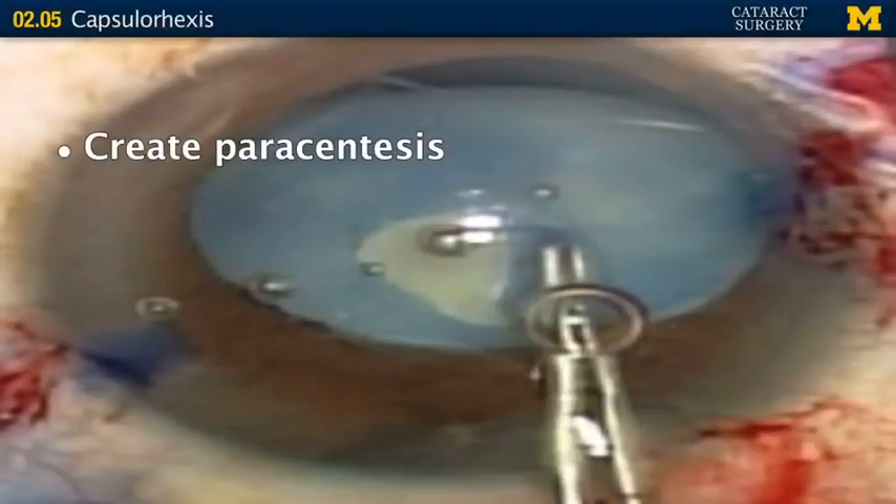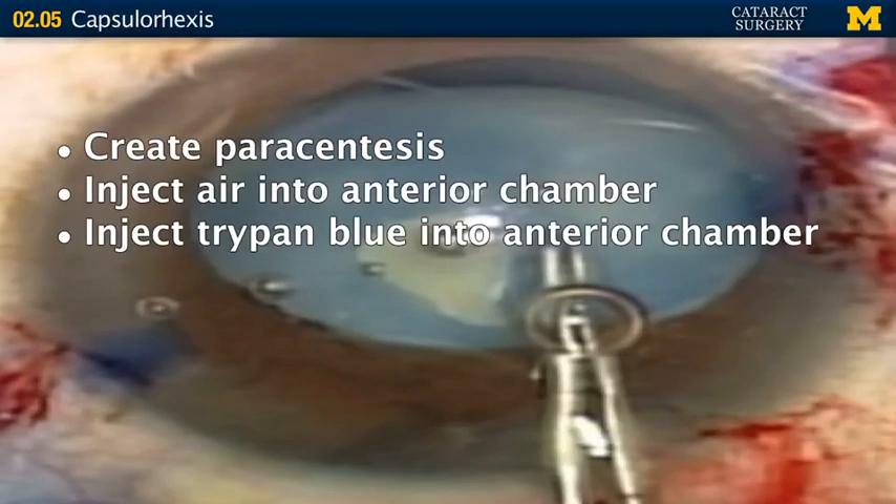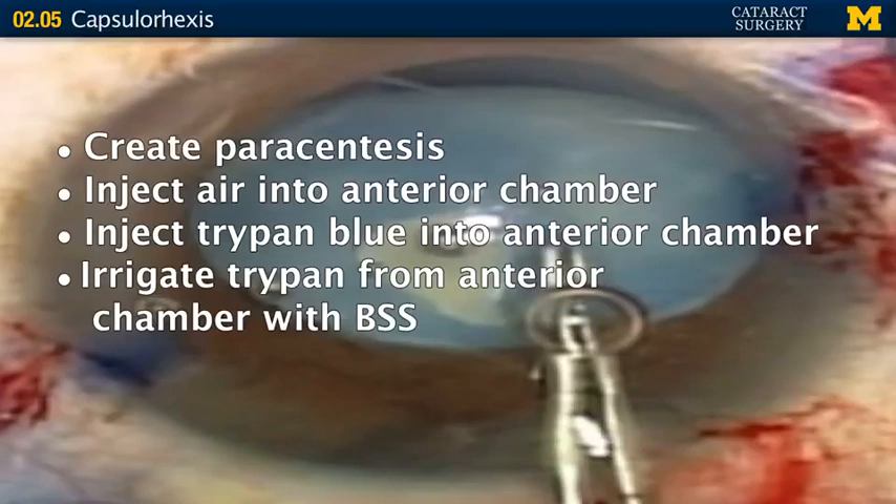You're going to create your paracentesis, and instead of immediately injecting viscoelastic, you're going to inject air into the anterior chamber. Then take your staining substance — we use trypan blue — and inject it underneath the air, at the interface between the remaining aqueous and the air, right over the lens. Once the capsule is nicely coated, irrigate the trypan blue from the anterior chamber with BSS, then proceed as usual — inject your viscoelastic and make your clear cornea incision.